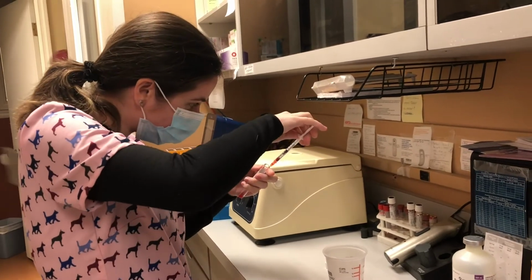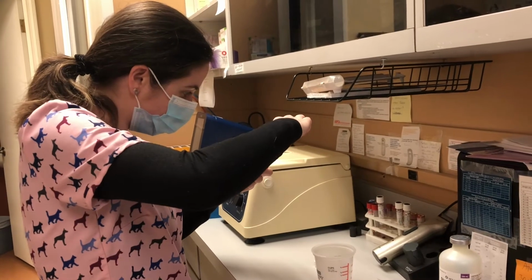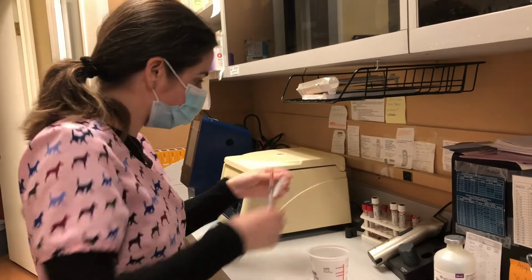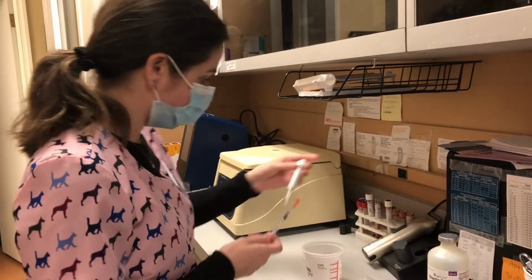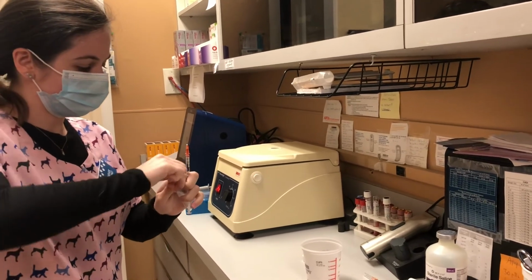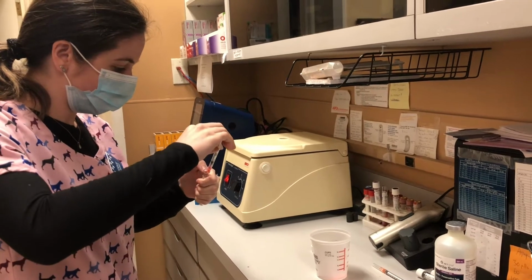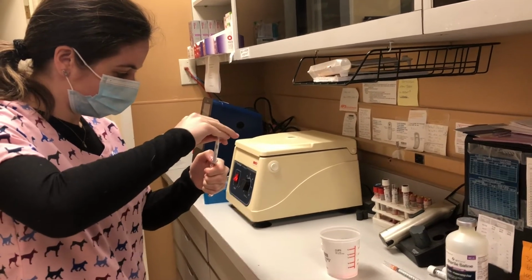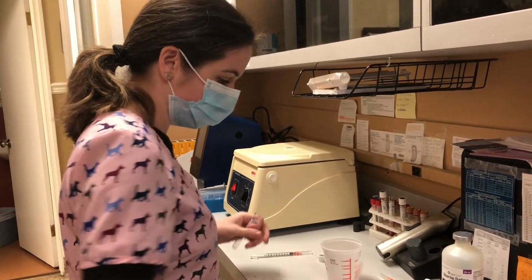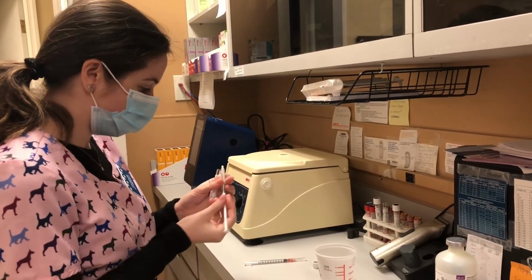Too much. I'm going to put that in my recipient labeled cell suspension tube, and then fill the rest of that up with my saline.